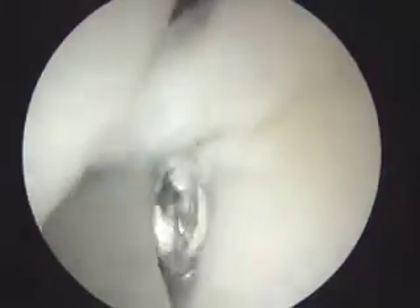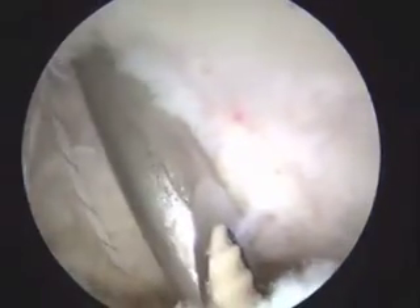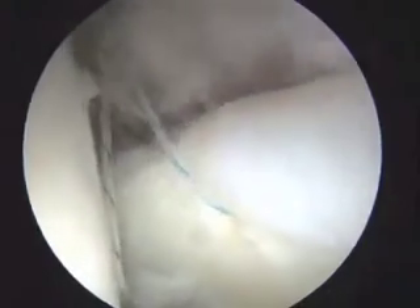We normally placed suture anchors from anterior to posterior. Suture can be looped around the labrum or passed through in a piercing fashion with a small suture passer. Knot tying must be placed at the capsular side to avoid knot impingement during surgery. We use strong suture for the labrum refixation.